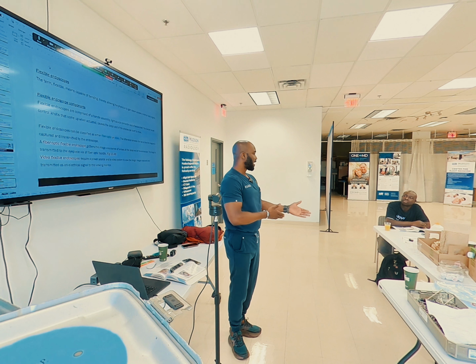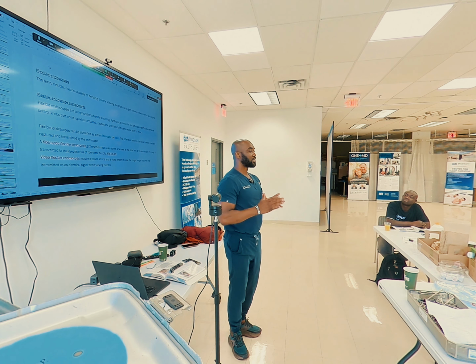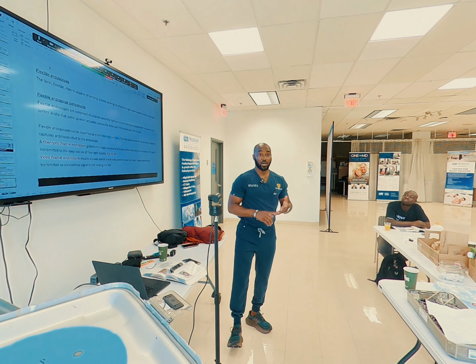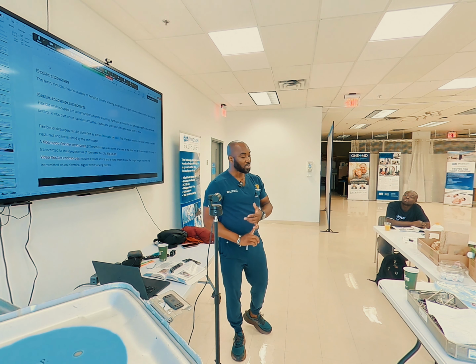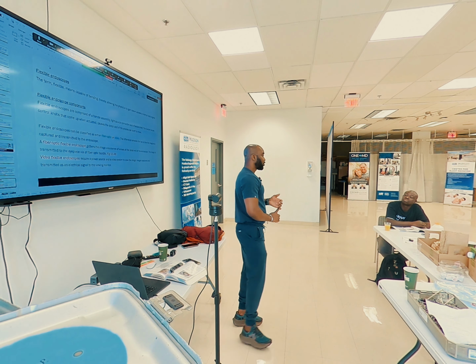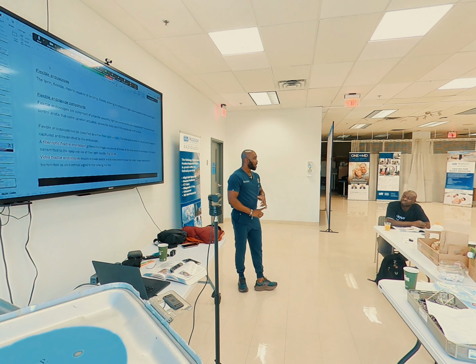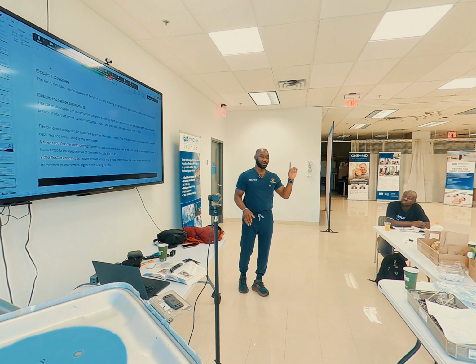If he says no, that's allowed. If he says yes, that's not allowed. Because every semi-critical device that requires high-level disinfection should only be disinfected using an automated endoscopic reprocessor. No more manual.